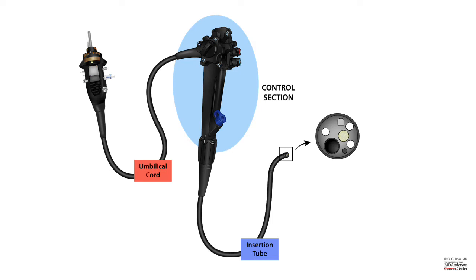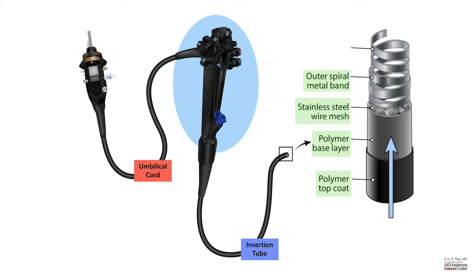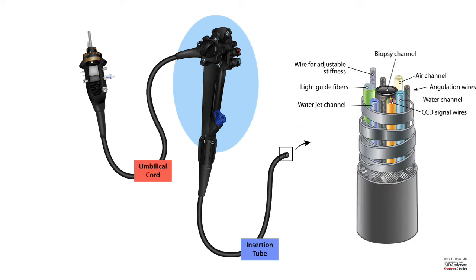The insertion tube is quite complex. Let us review the structure of an insertion tube from outside to inside. It has an outer polymer coat, a base layer, stainless steel wire mesh, outer spiral metal band, and inner spiral metal band. As you can see here, it is a very complex instrument with several layers of wall, and inside the wall we see different structures.